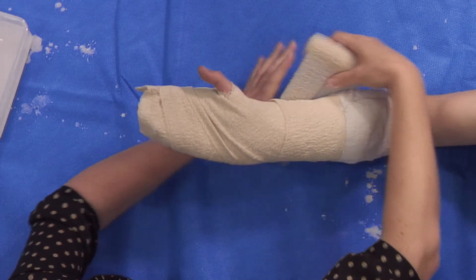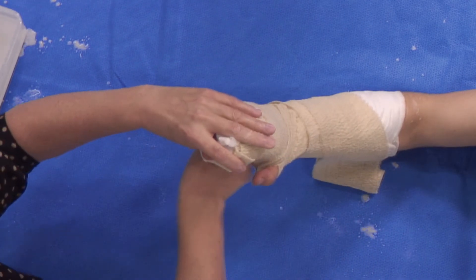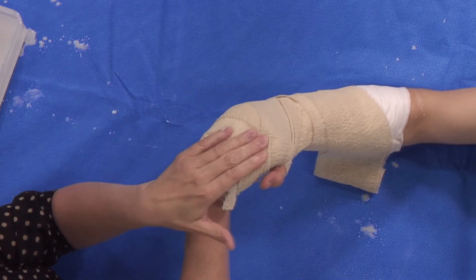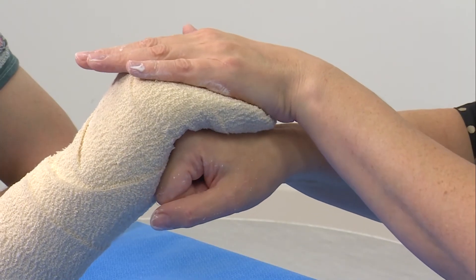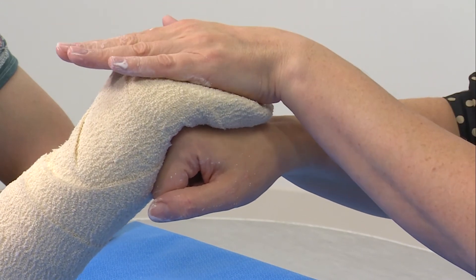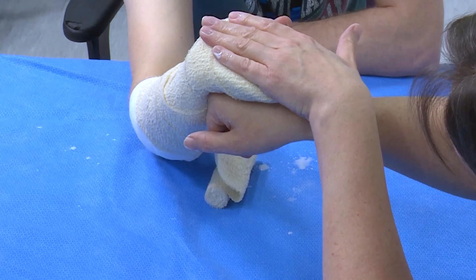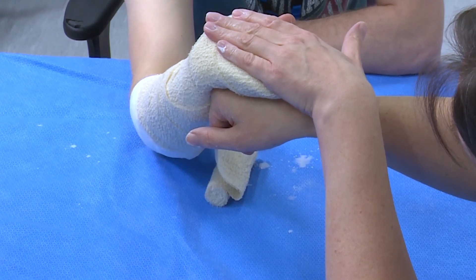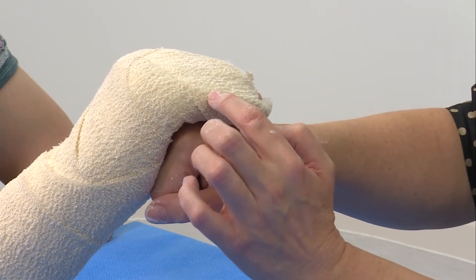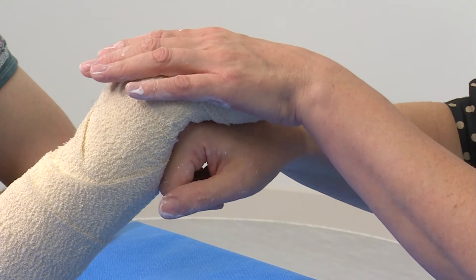If necessary, I'll just drop the crepe at that point and sort that out afterwards. Remember, I'm aiming for the MCP joints to be at 90 degrees and the PIP joints to be straight. The most effective way I've found is to place my own fist into the patient's palm and push their fingers down onto the back of my hand, sandwiching the fingers between your two hands. The commonest error is to make the flexion in the plaster too distal, so it's actually flexing the PIP joint rather than the MCP joint.